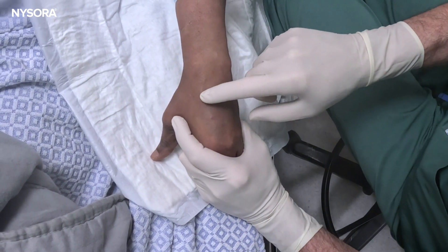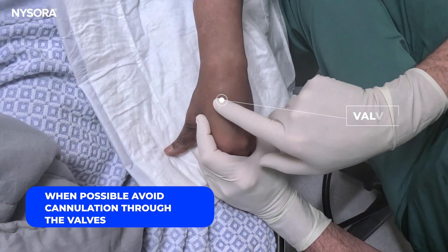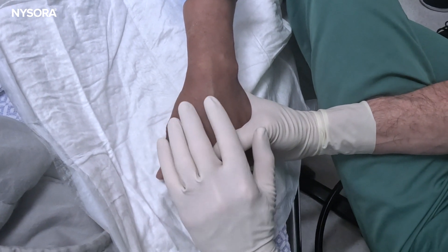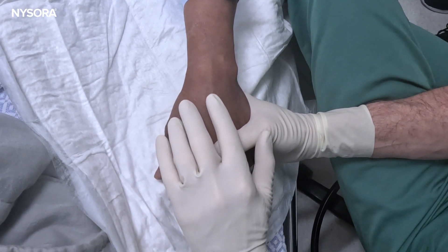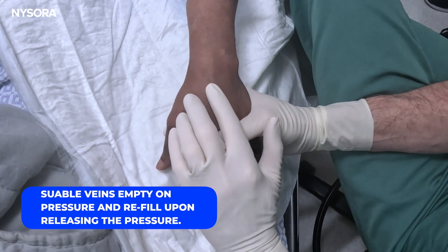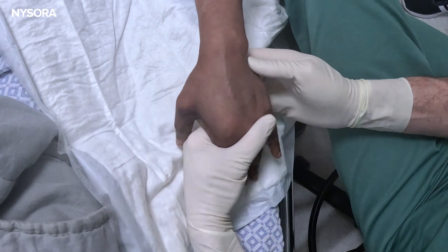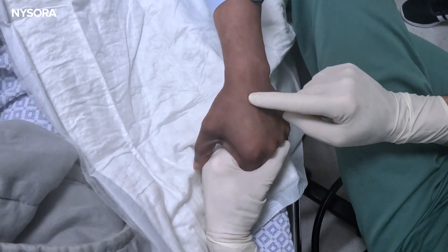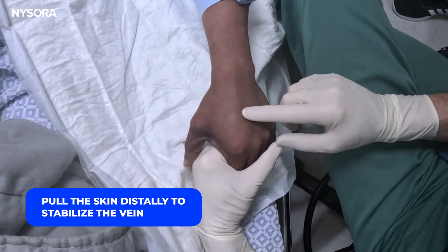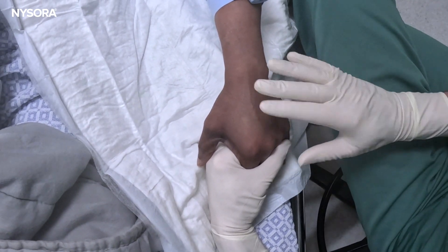That's definitely a viable vein. Here we can actually see the valve inside the vein — it's palpable. It's definitely a possibility because I can feel that it's filled and it's not thrombosed, because under thumb pressure it clearly collapses and empties. Although it's very easy to roll, so it's very important to do acute, very good stabilization of the vein before attempting to cannulate it.